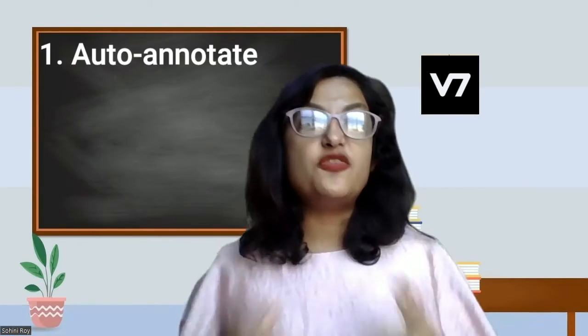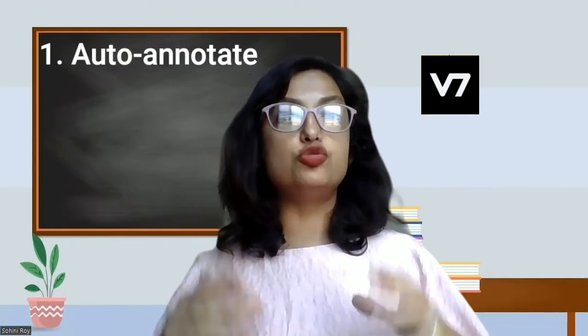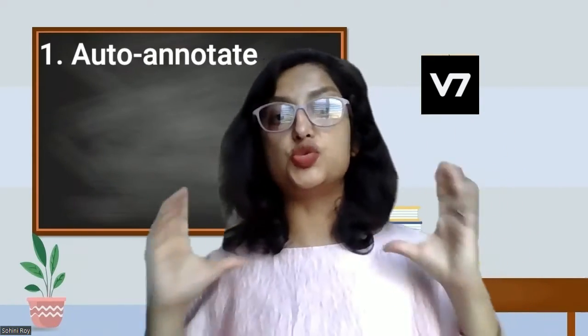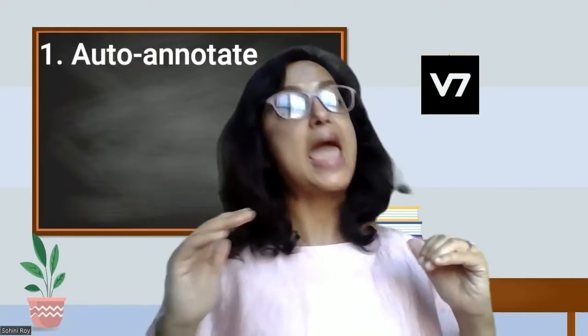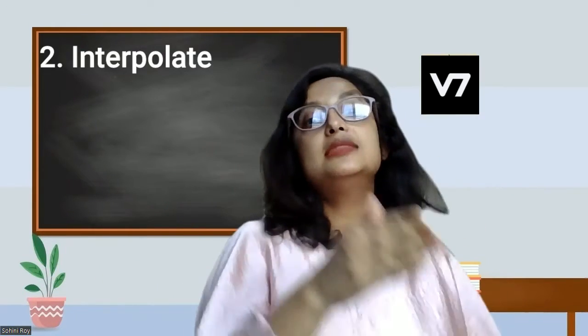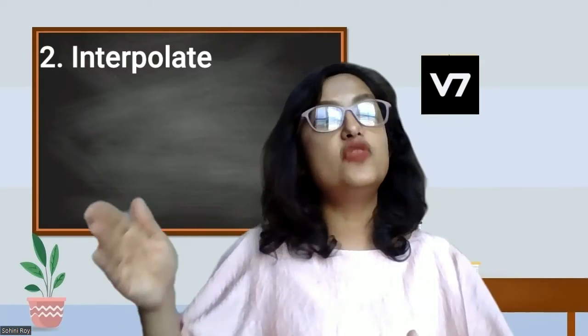Hello everyone and welcome to AI with Sohini. Today we are going to be exploring the software called V7, an online platform. The specific functionality is called auto annotate, which allows you to automatically generate annotations for regions within a selected region of interest. We will also look at the interpolate functionality that carries over these annotations across frames.